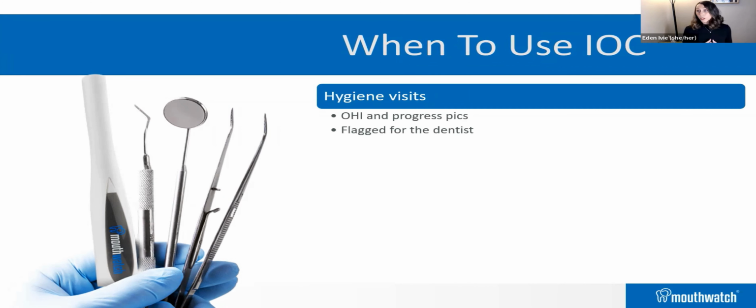So personally, I like to snap a picture of anything that I'm going to bring to my dentist's attention. And then as I'm waiting for my exam, I can go through those images with my patient so that they understand what I'm looking at, why I'm concerned. And then when the doctor comes in, he can either confirm or he can say, no, that's not really an issue. We don't need to worry about that right now. But then the patient is already open and ready to accept that treatment. They've already heard it from me, they've seen it, and then they hear it from the dentist.